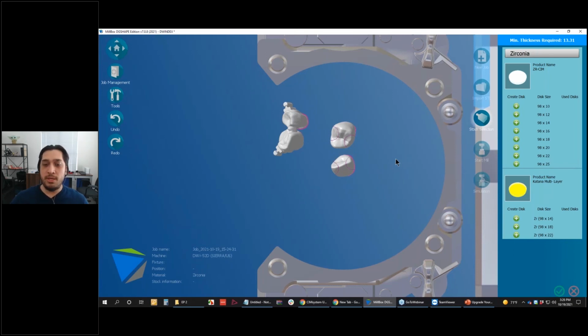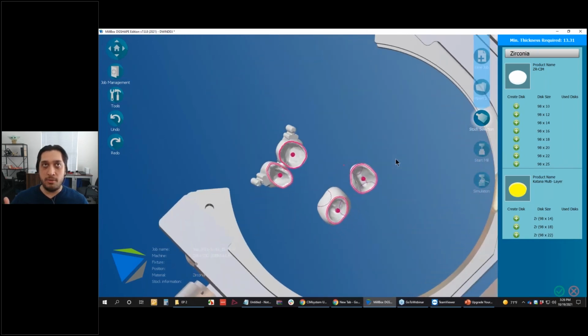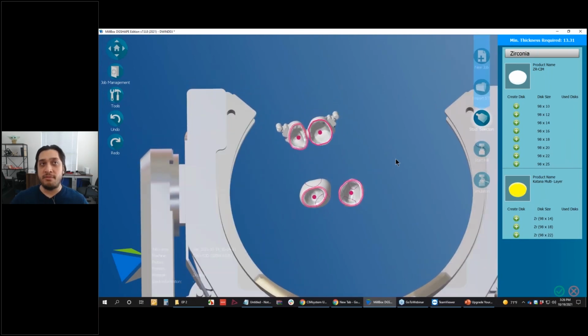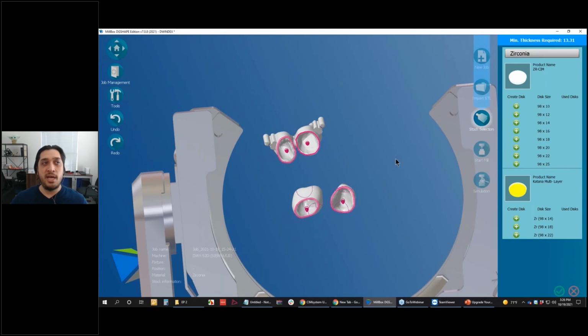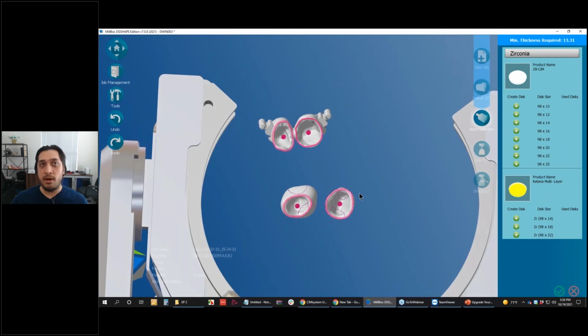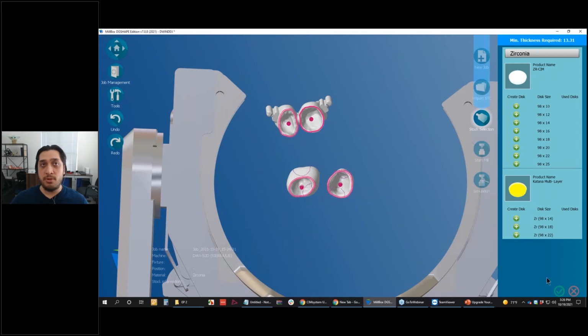Usually when we run into those issues that come across the help desk, customers are telling us, oh, well, we've been milling PMMA for years and we've never had this issue. But really, when we dig down into it, we find out, oh, we're using a new, let's say, harvest PMMA or something like that. That PMMA sometimes has a lower melting temperature versus others that are out mainstream on the market. And as a result of that, you actually have to use slightly different cutting parameters. So in those situations, you always want to talk to your dealer, work with your dealer to figure out, hey, what's the best material for me to use? Or there may be a material available that you didn't know about.